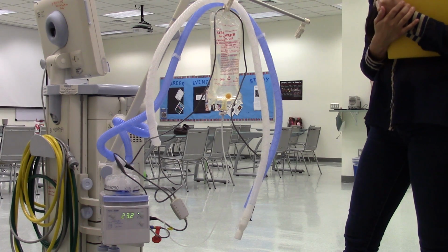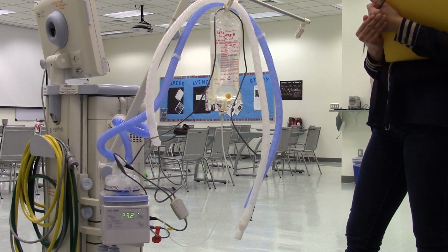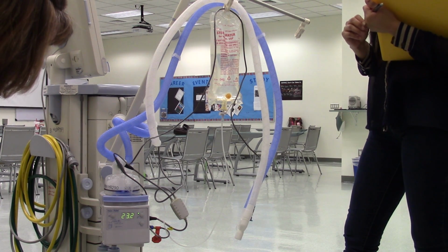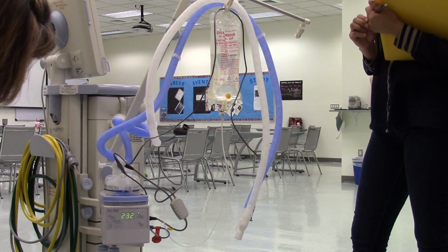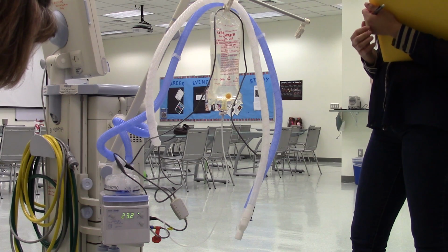I thought 37 was body temperature. That's what it is. Which temperature is that telling us? Is it telling us the temperature of the fluid, or the temperature at the patient end? It's telling us the patient end right now.